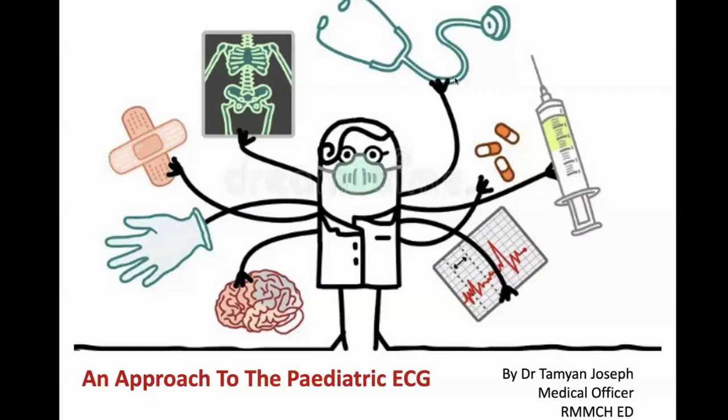My name is Tamyan Joseph. I'm a medical officer in the emergency department at Rahima Musa Mother and Child Hospital. I am by no means an ECG guru, but I would like to share with you the little bit of ECG knowledge that I do have.